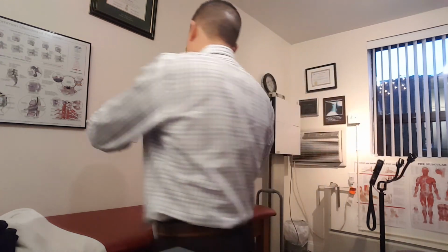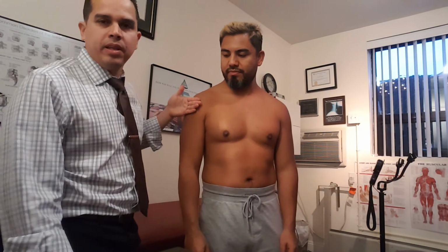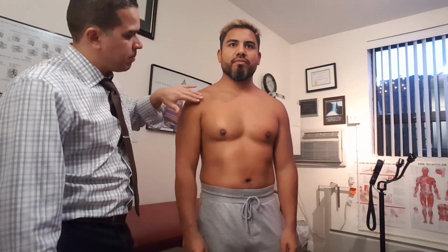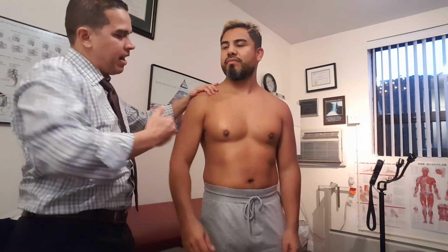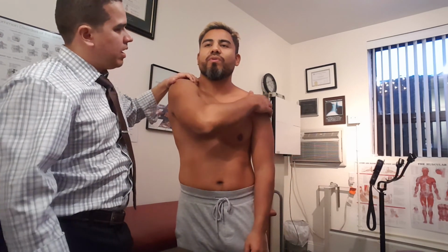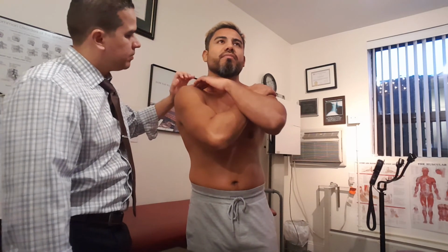All right, so let me turn this way. So now, here we go. We were dealing with the deltoid sprain, and we were dealing with some of the pec sprain. Now, move your arm in again, as if you were going to grab a towel, and point with this hand exactly where you're feeling the pain.